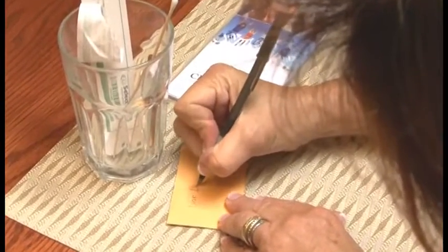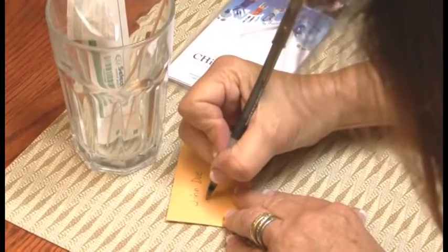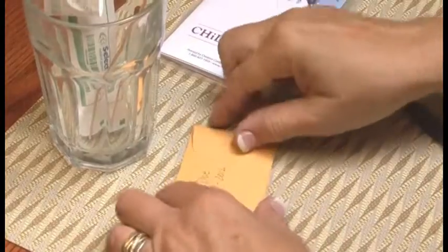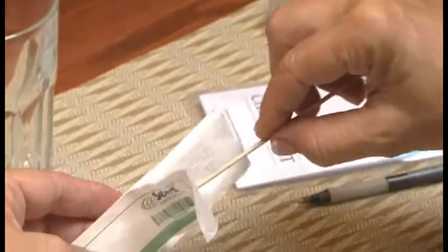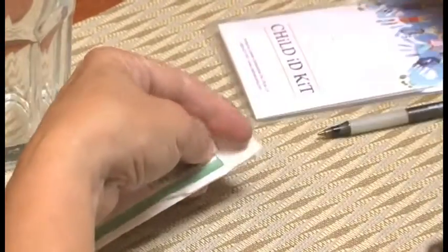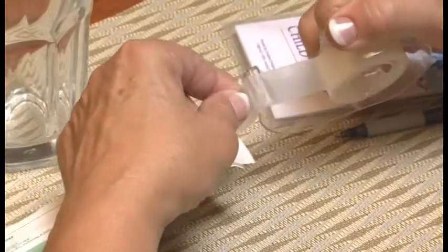Carefully close the flap on the collection card and return it to the DNA sample envelope. If you choose to seal the envelope, you might want to write your child's name and the date the sample was taken on the back of the envelope. Return the dry swab to its paper carrier, fold over the end flap, and seal it with Scotch tape.